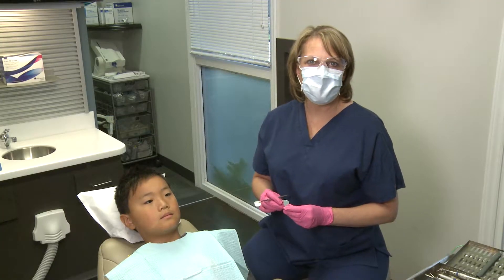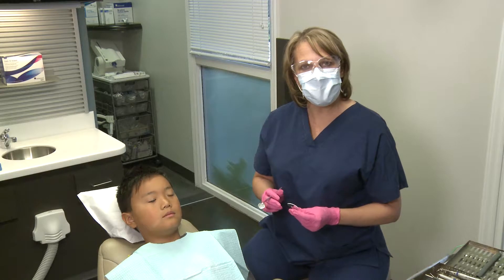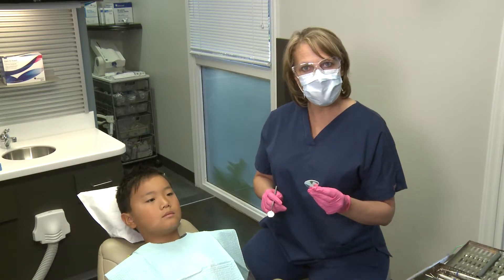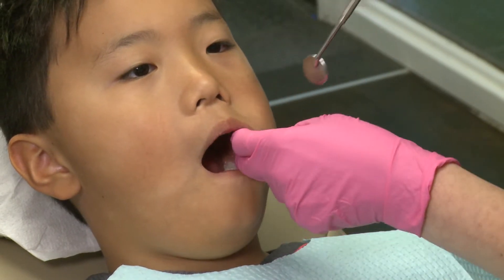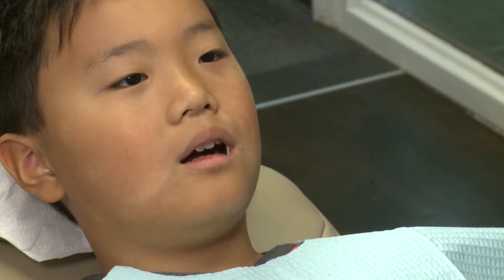Hi, I'm Courtney from Richmond Dental & Medical. Richmond's Reflective Shield Plus was designed for our company by a dentist who wanted the heart-shaped absorbent pad to fit comfortably in the buccal curvature of the cheek and stay in place during the restorative procedure.